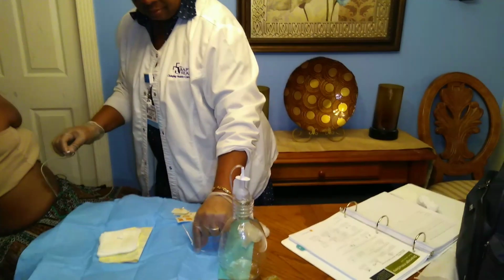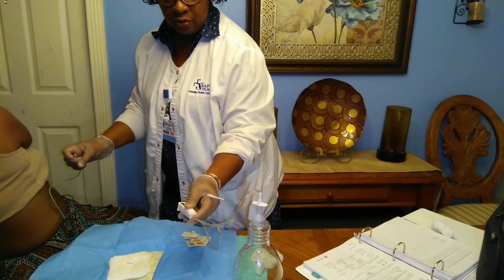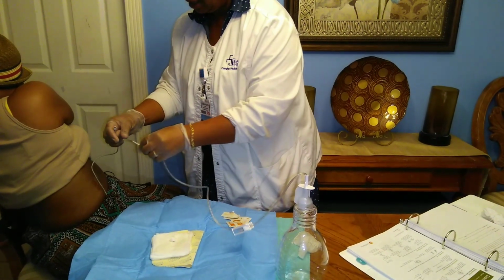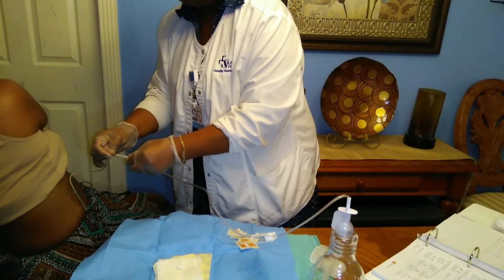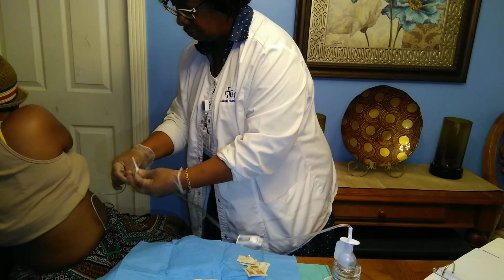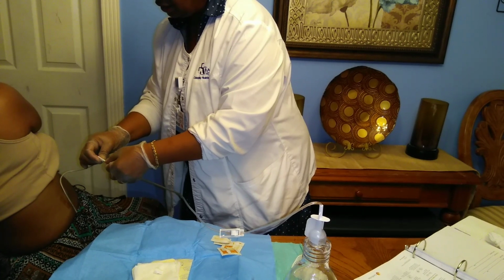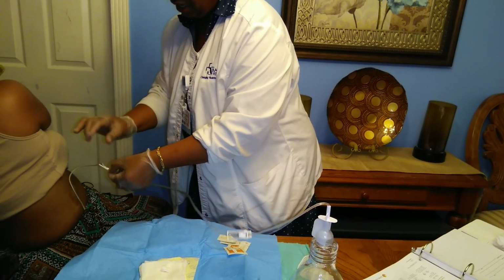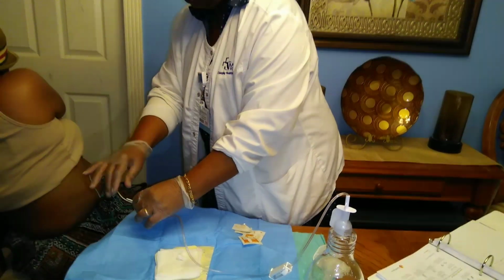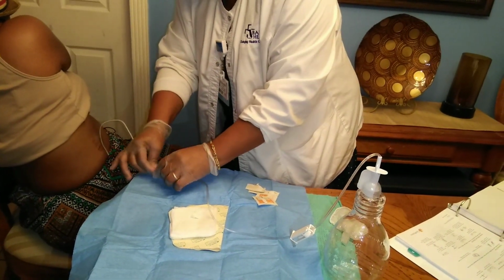Then I would take my canister cap, making sure my roller clamp is completely closed. This part is sterile, so you want to make sure you don't touch it on anything. I take my cap off of here. It just kind of pops loose like this. And this fits on here, and it goes in counterclockwise and it clicks. Okay, this is not a real catheter, so it clicks, and this is considered the sterile field here. So this is here. We're just pretending that that's connected.